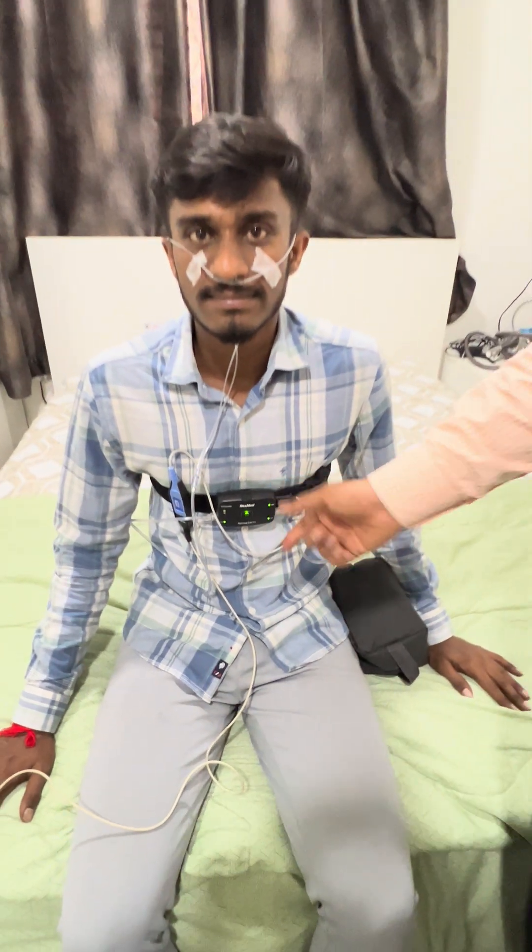Once recording is done for eight hours, the next morning we can disconnect the device, connect it to the system, and download the report. Thank you.